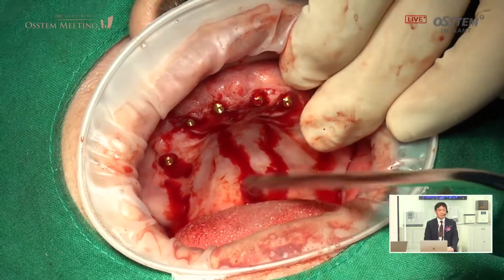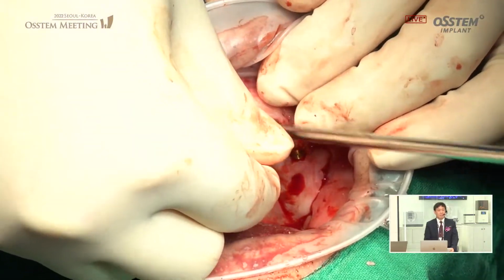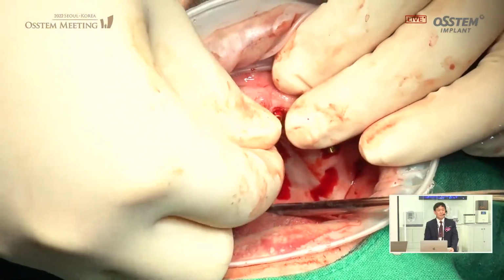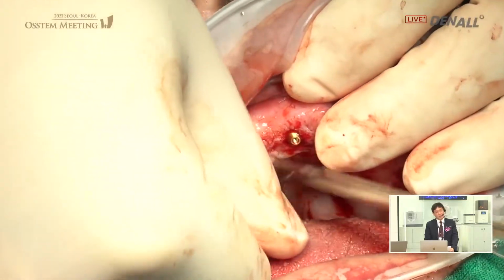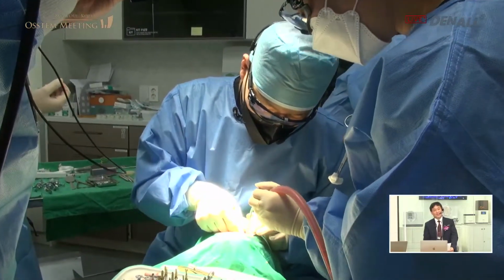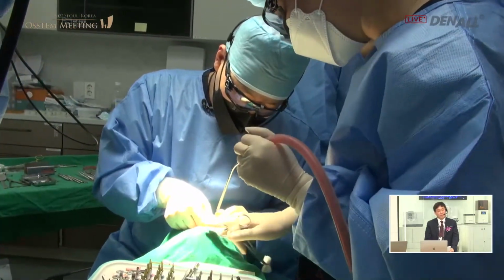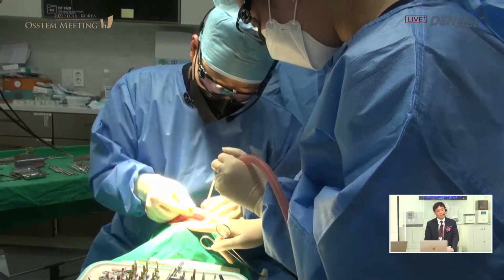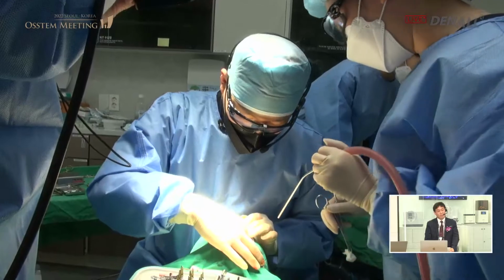In this stage, the driver, if it hits, is good, but if it doesn't, so I'm going to ask the patient to close slightly. The driver, it looks like you can do hand screw.